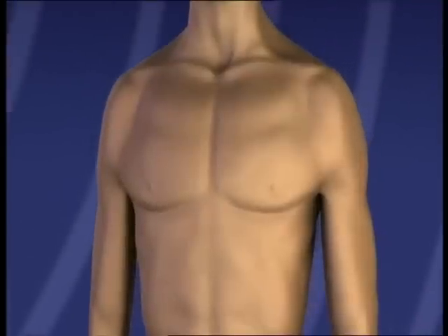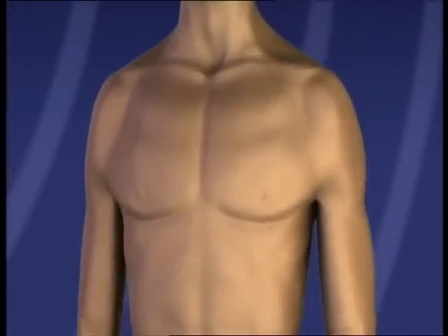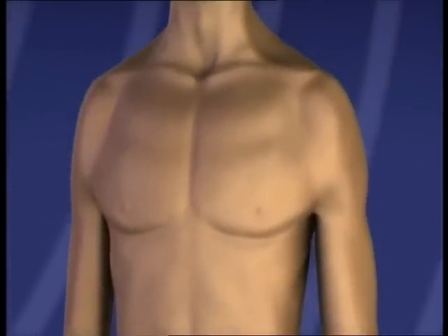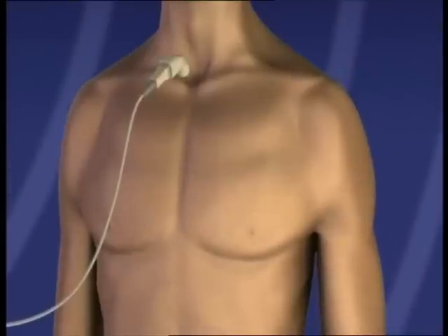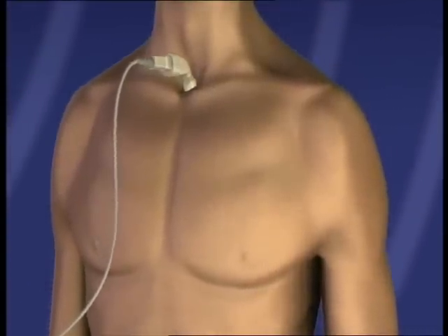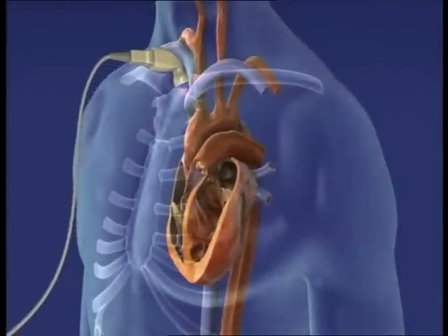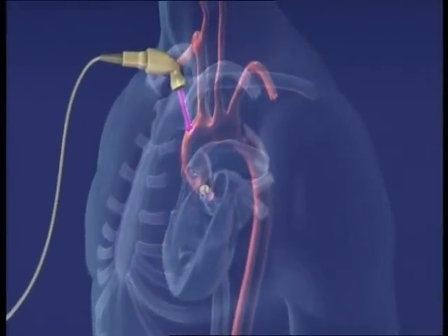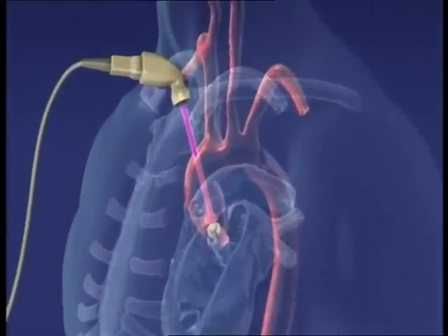To calculate left cardiac output using the USCOM ultrasonic cardiac output monitor, a small non-invasive probe is placed in the suprasternal notch aiming directly down the longitudinal axis of the ascending aorta and across the aortic valve.